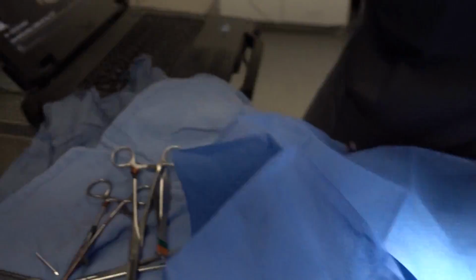All right, so I just took this out. This is the little pin that you can see on the radiographs. This is this one up here on the top. So I'm really hoping that makes her more comfortable. I'm just gonna suture her up real quick and wake her up.